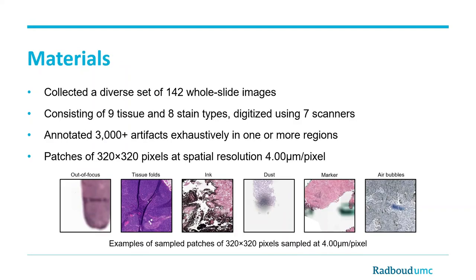To train the artifact segmentation module we collected a diverse set of 142 whole-slide images. This dataset consisted of nine different tissue types and eight different staining types, and the whole-slide images were digitized using seven different scanners. In total we densely annotated more than 3,000 artifacts in one or more regions of the whole-slide images. Due to the extremely high resolutions of these images, we sampled smaller patches, which were then fed through our artifact segmentation module for training.